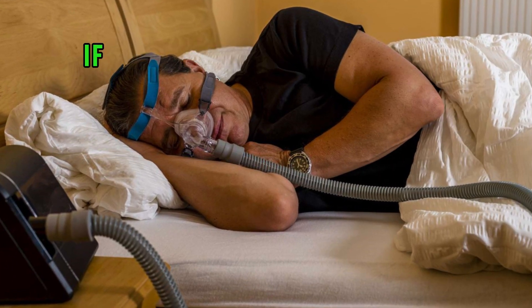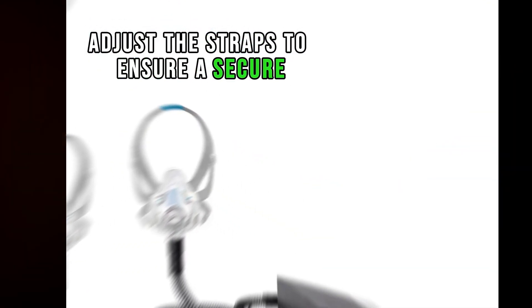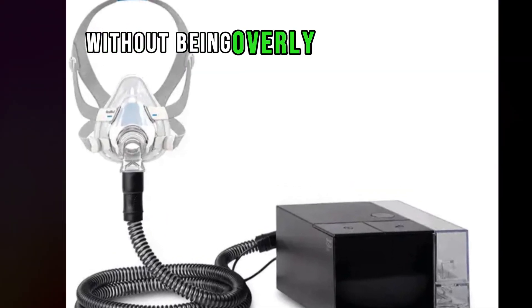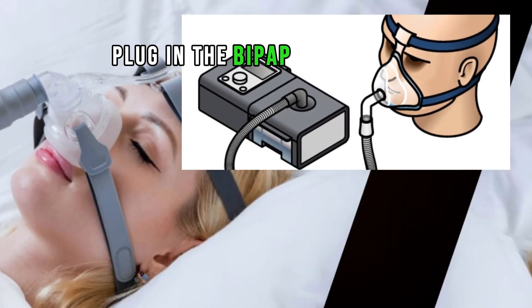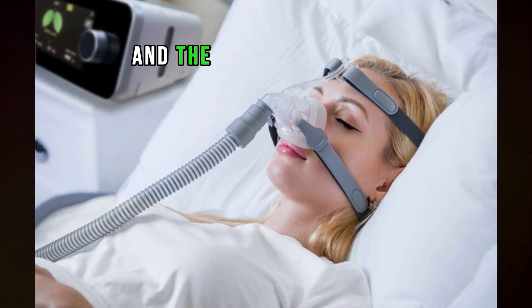Adjust the straps — if you're using a mask, adjust the straps to ensure a secure but comfortable fit. The mask should create a seal without being overly tight. Then connect the machine: plug in the BiPAP machine to a power source and connect the tubing to the machine and the mask.